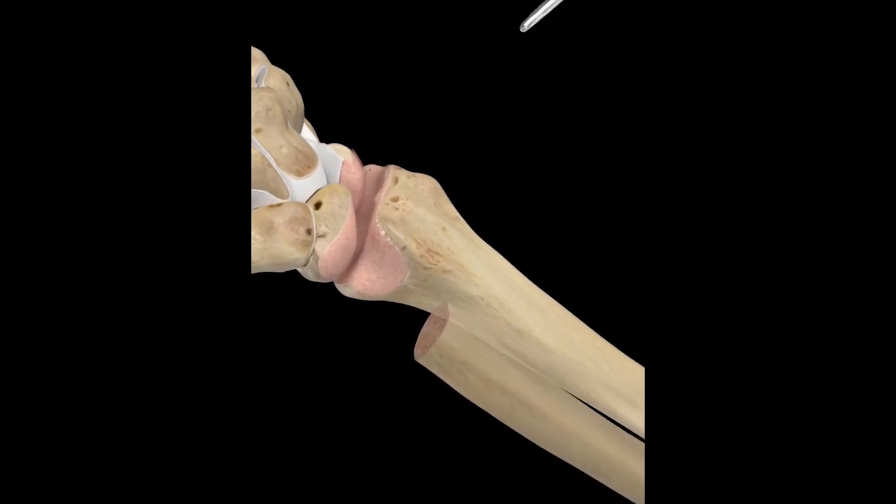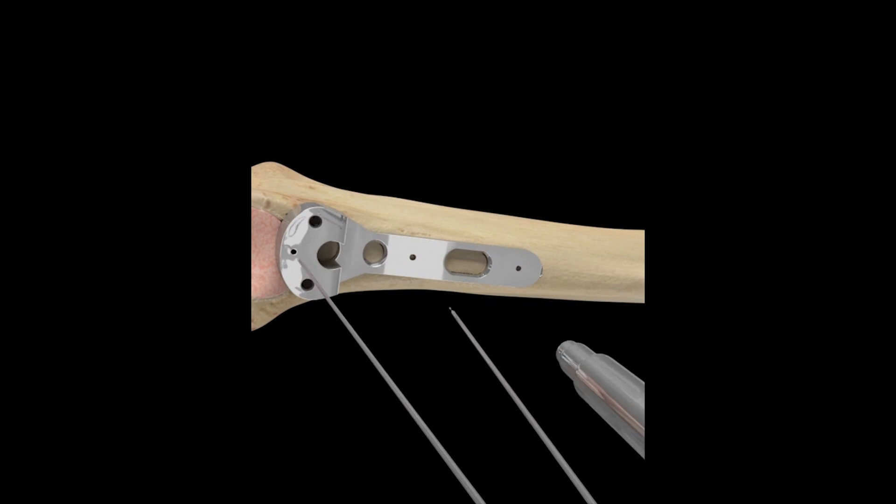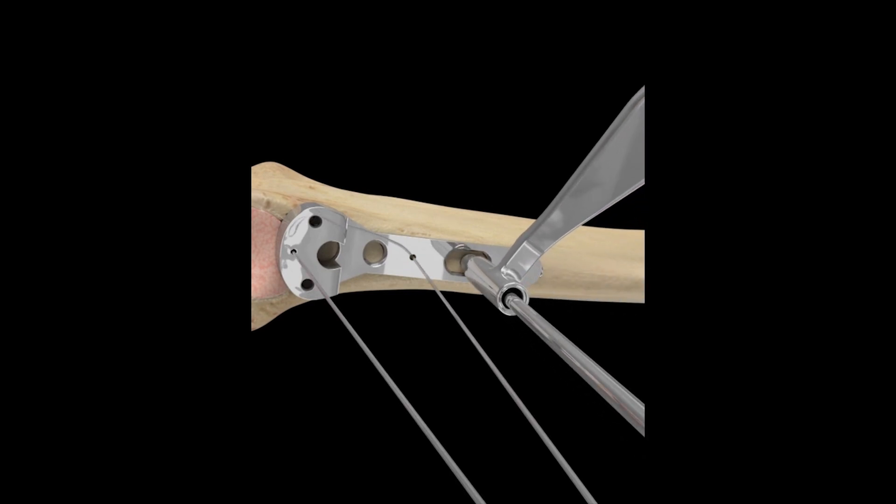A bone saw will remove the damaged cartilage and shave the bone down in preparation. The surgeon will then insert a radial implant plate and screw it down to the radius.